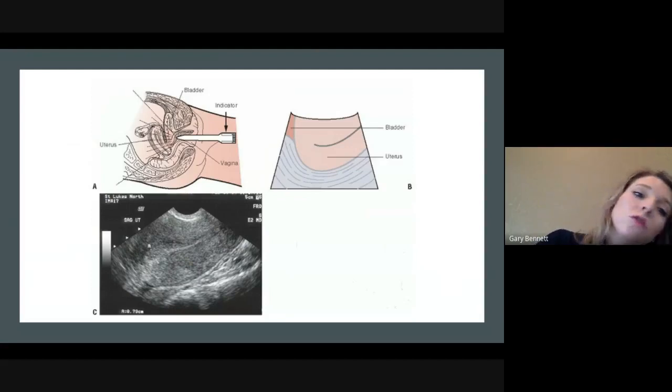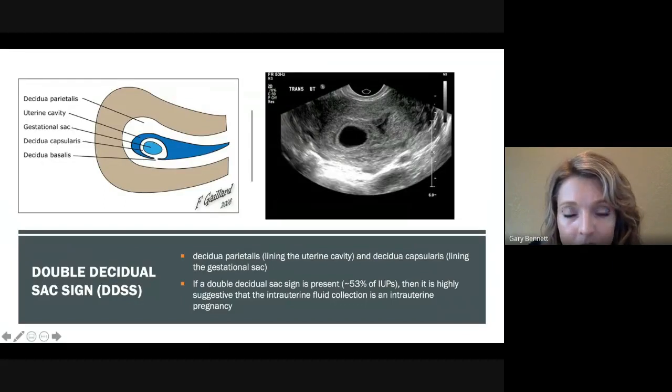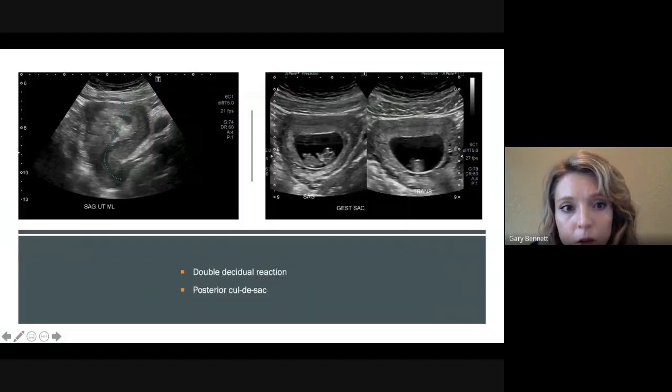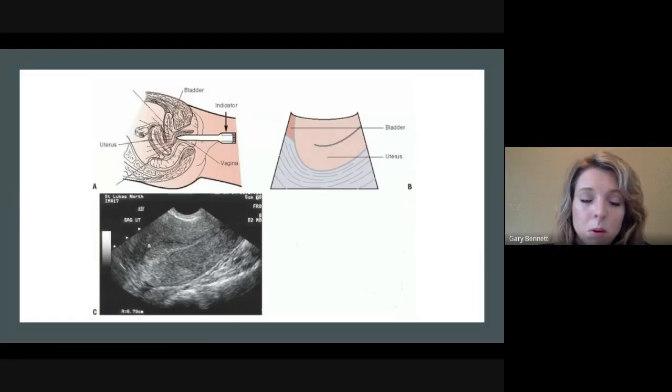Okay, so some orientation now for endovaginal ultrasound. Up until this point, we've been imaging, that's actually an EV ultrasound. These are all going to be transabdominal ultrasounds right here, again just coming right below the umbilicus to obtain these images. But another method of obtaining similar imaging without a lot of the bowel gas issue that we have is going to be this right here.